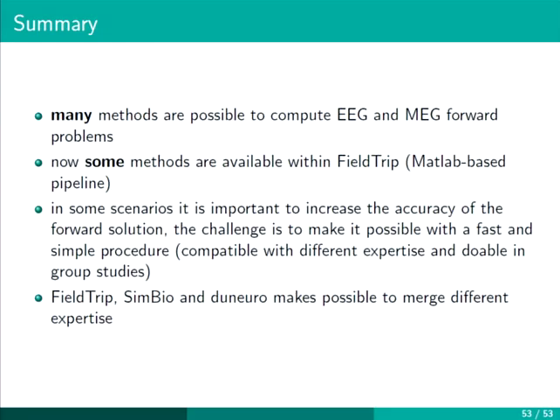Of course, you have to make sure that they are living in the same space. With the EEG it is relatively easier because, yeah, for EEG, I don't have a quantitative reply. Just half a centimeter up here, just a few points. At the back of the head you have a centimeter.